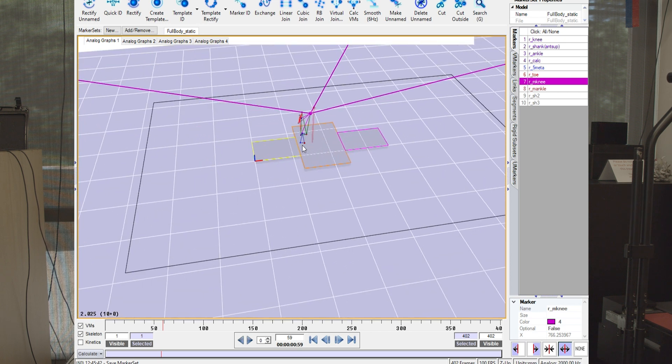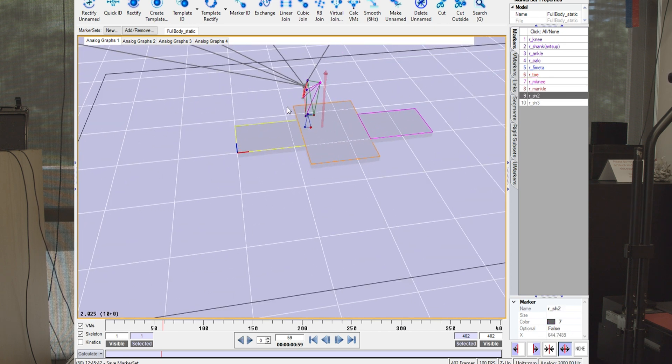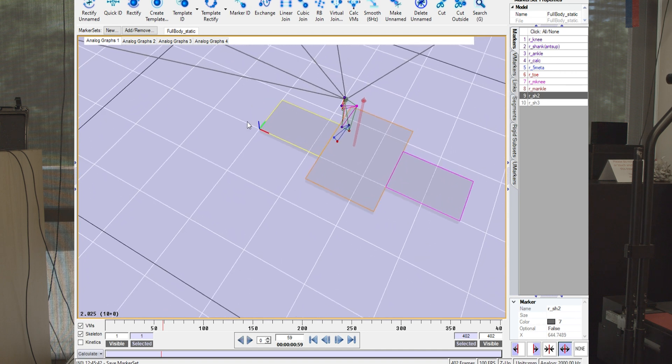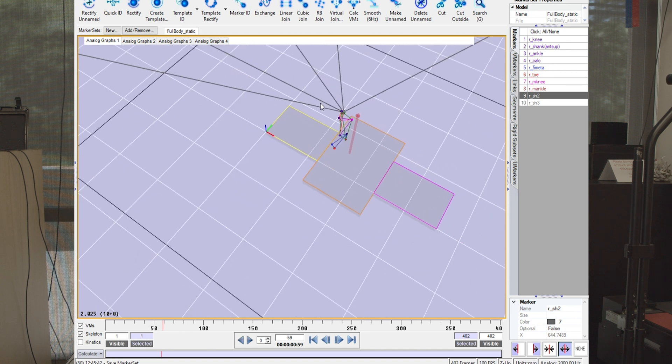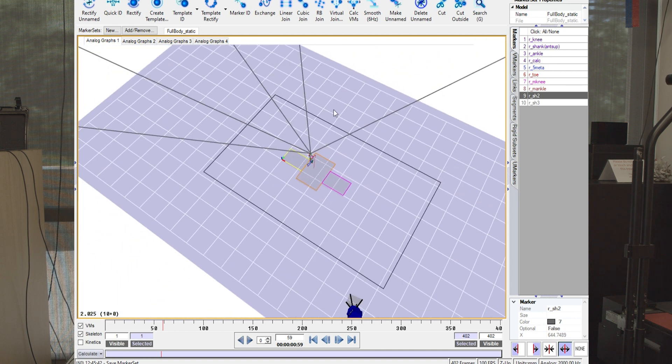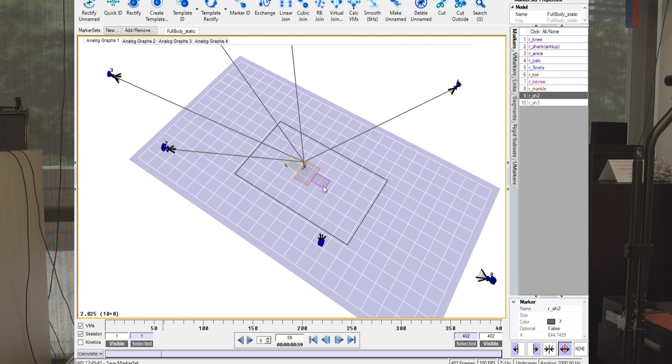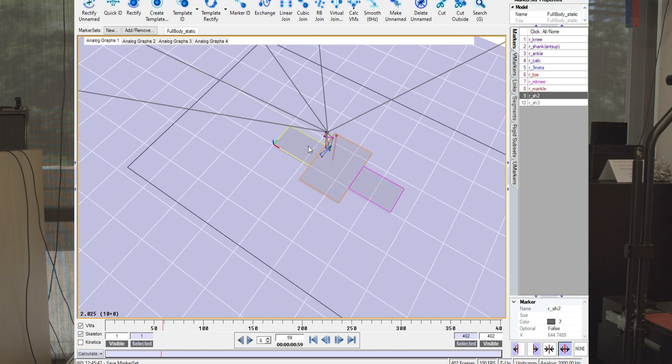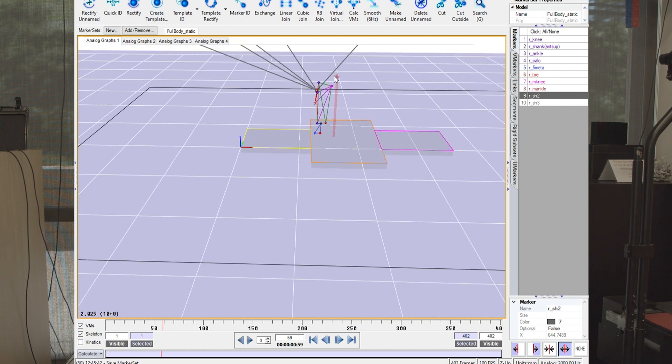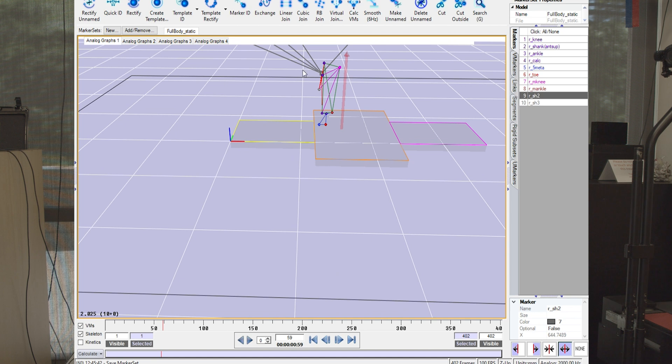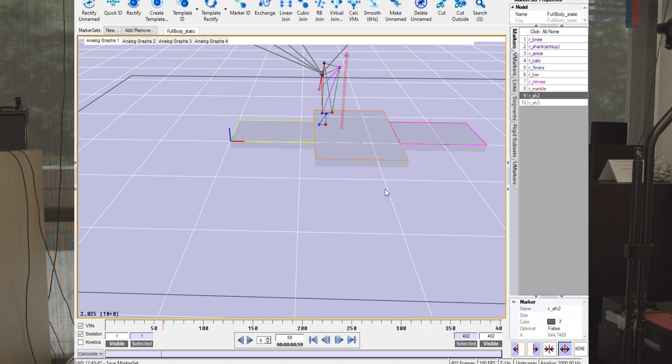But if we look at the tracking system that we usually rely on to track motion, you can see these five rays and it's caught by these five cameras. So the motion for this marker is going to be more accurate than the motion tracked by our anatomical medial knee marker.